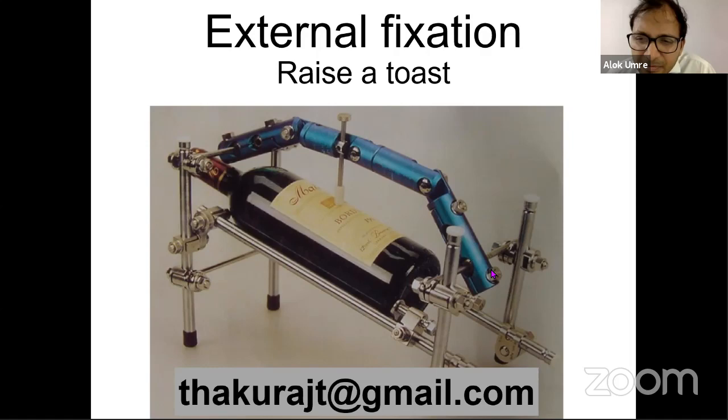Yes, sir. Please. In metaphyseal fractures, the hybrid fixators give more advantage. Especially when you are talking about the metaphysis, the fracture at the end of the bone, the hybrid fixators are more useful than the other fixators.